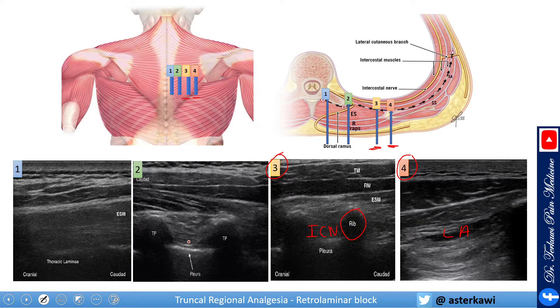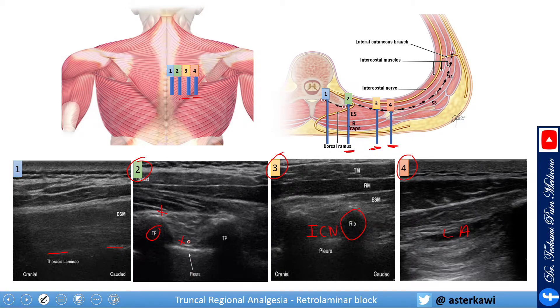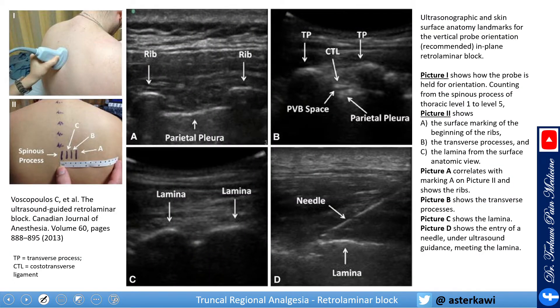Keep going more medial — now you are very medial. Looking at position 2, you are above the transverse process, so at this level you can either do the erector spinae muscle plane block or go all the way down and do a paravertebral block. Keep going medial and now you see a flat line — this is the lamina. Here you do the retro laminar block.